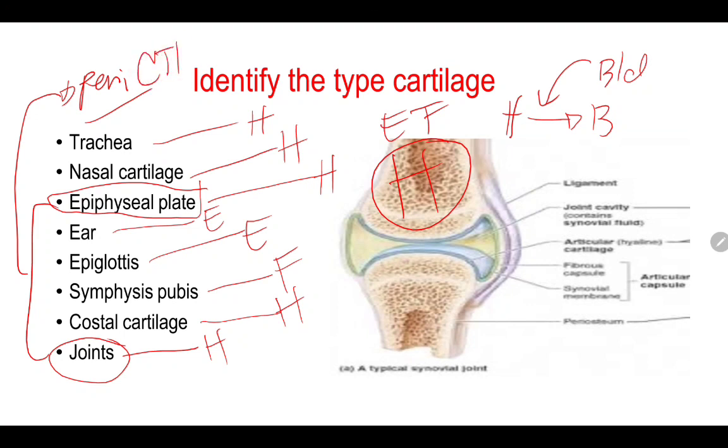So, remember, if your epiphyseal plate, guys, has perichondrium, do you think the blood vessels here can infiltrate it? No, it's because of the collagen type 1. So that's why, despite the fact na hyaline cartilage ang meron sa ating epiphyseal plate, it doesn't have the perichondrium. Same thing with our joints. Okay? So imagine if your joints have perichondrium, how can you move? It will really be painful because magiging strong siya. It needs to be able to make the bones glide together, diba? Ganun lang ang purpose ng joint. So that's why it is hyaline cartilage, oo, but it doesn't have the perichondrium.